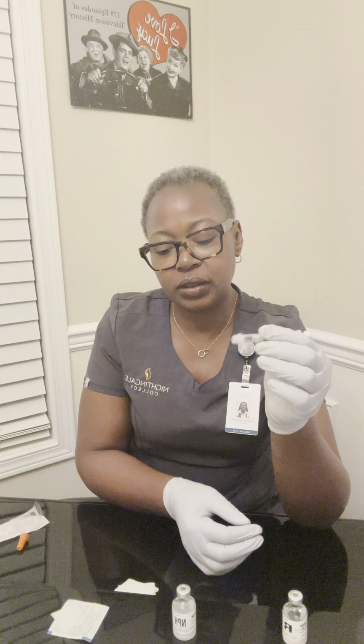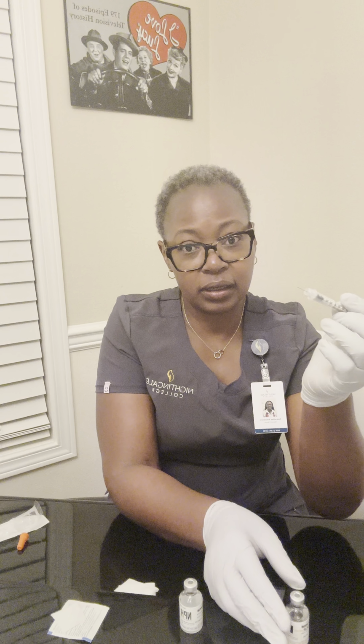I'll be careful not to contaminate the needle with the intermediate acting insulin, so I'll not go all the way deep. So I'll inject the air into the intermediate acting insulin, remove it, and then draw 4 units of air, and I will go ahead and inject this in the short acting insulin.